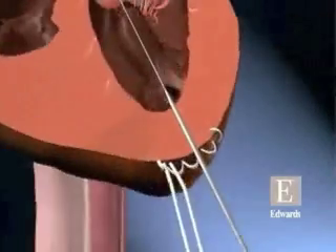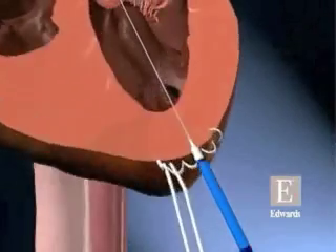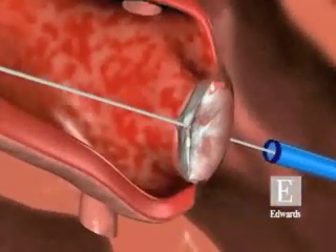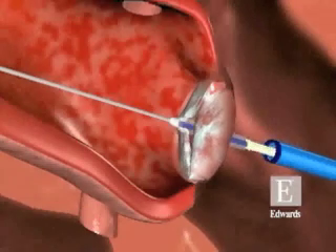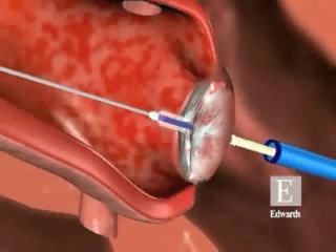An incision is made in the apex of the heart and a wire is placed. A balloon is then brought up and used to open the native aortic valve. The balloon catheter is then removed.